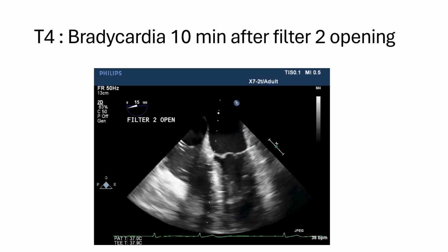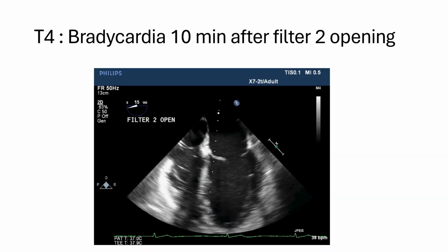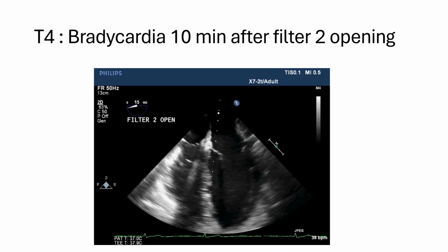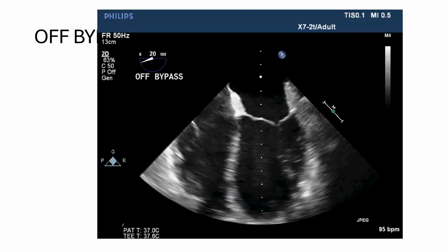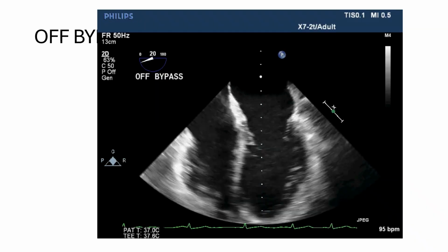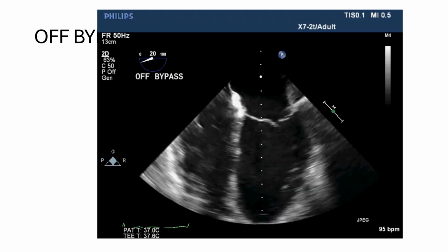I think it's important, since we have some incidents where someone can get significantly hypotensive and it requires early recognition and treatment, so a TEE can be very, very helpful in those cases. This is off bypass. We can see the heart is full again, and it's starting to beat, and the heart rate is picking up.